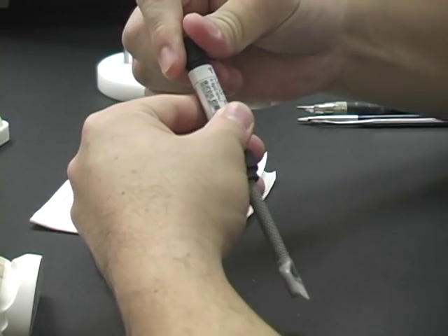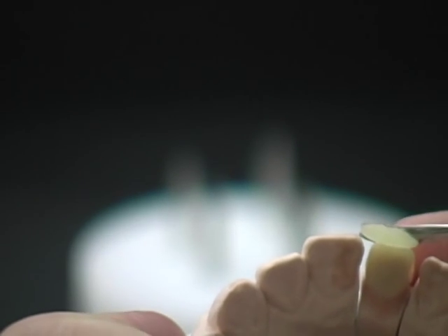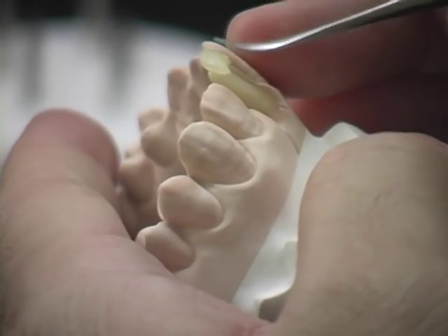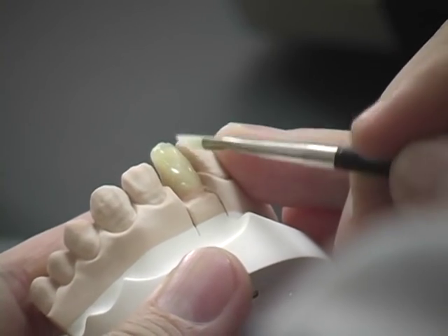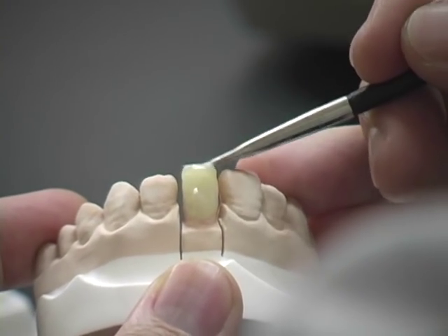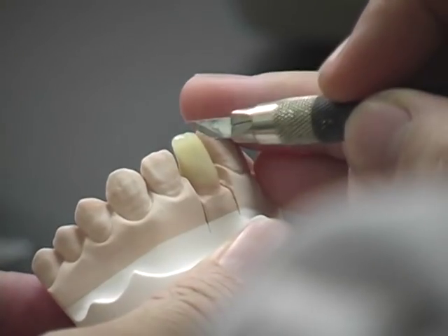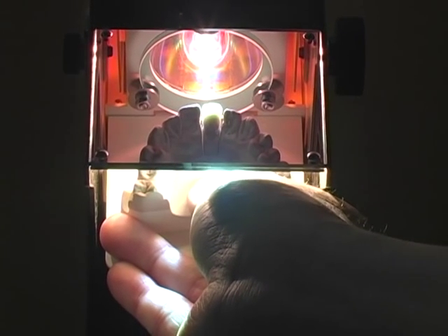Select the Ceramage translucent shade and take the required amount with a composite instrument. Build up the incisal area to obtain a more natural translucent effect. Smoothen the surface with a brush and build up to the final form. Use the cutting knife to create the mamelons. Then place in the curing unit for a temporary quick cure to stabilize the material.